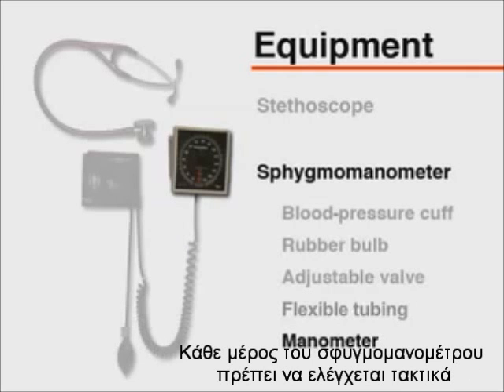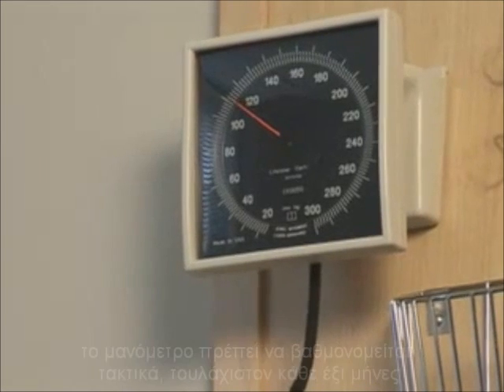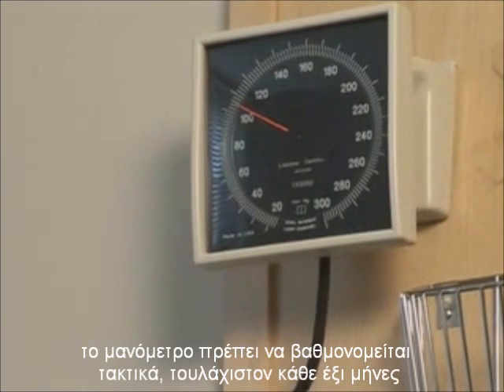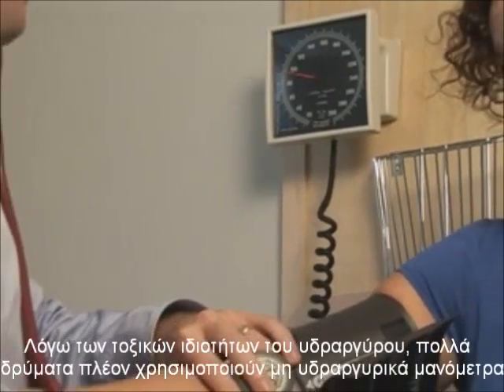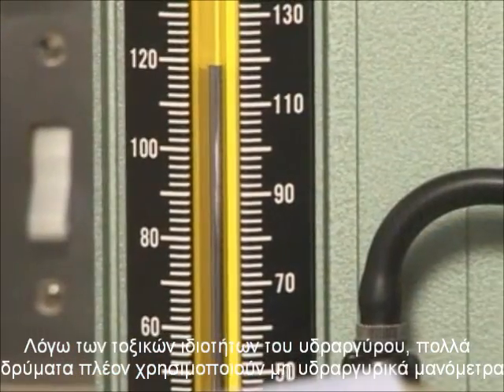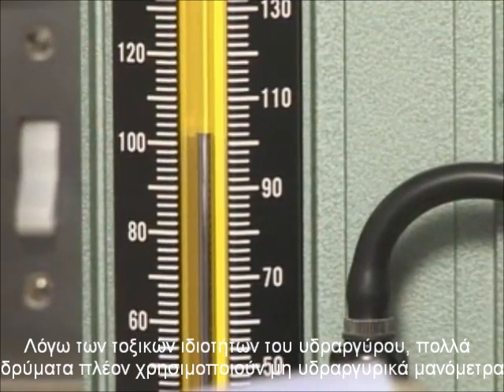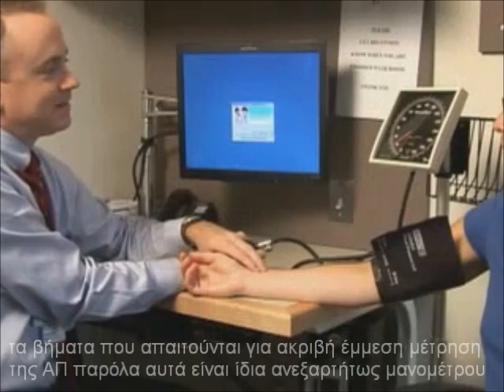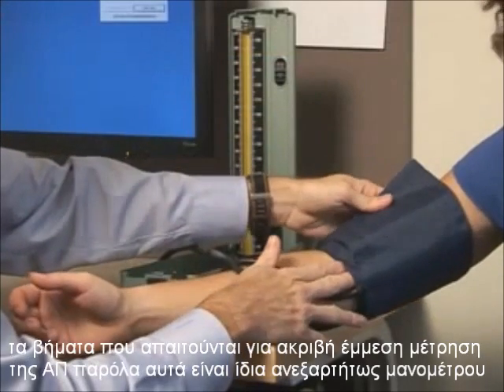Each part of the sphygmomanometer should be examined on a regular basis. The needle on an aneroid manometer should rest at zero before and after measuring blood pressure. Aneroid manometers should have scheduled recalibration at least every six months. Concerns over the toxicity and environmental impact of mercury have led many institutions to use aneroid manometers exclusively. The steps required for accurate indirect measurement of blood pressure are identical whether using an aneroid or mercury manometer.